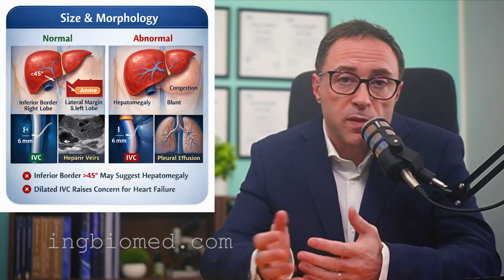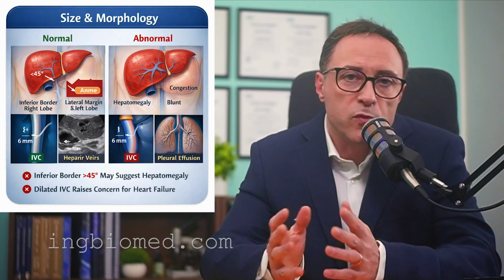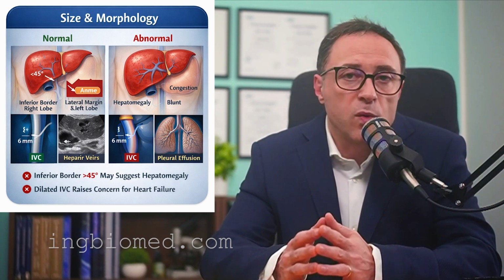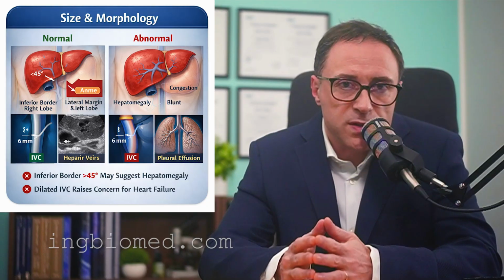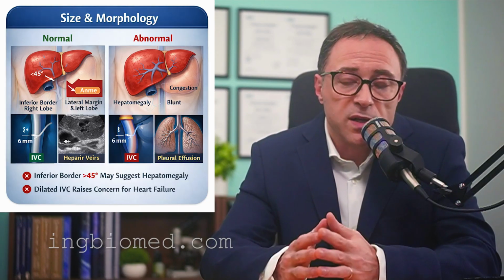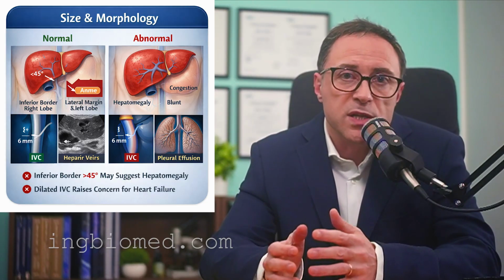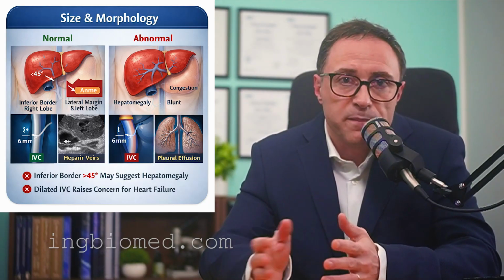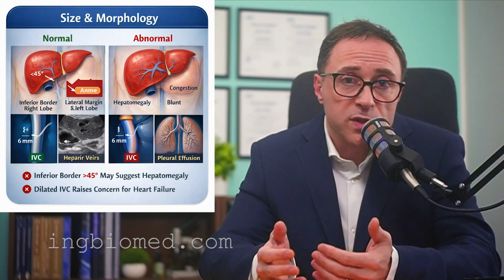In the transverse subcostal approach, especially on the right side, we can effectively evaluate the confluence of the hepatic veins into the inferior vena cava. In normal conditions, the peripheral diameters of hepatic veins should not exceed 6 mm. Dilatation, particularly in association with an enlarged inferior vena cava and reduced inspiratory collapse, raises suspicion for right-sided heart failure. In advanced cases, we may also detect pleural effusion, adhesion to the diaphragm.